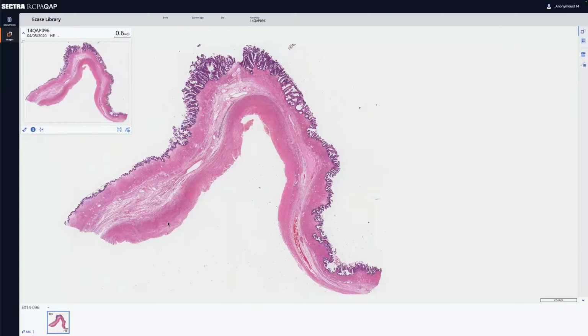And I would say if more than 10% looks borderline in the sampled material, call it borderline, because I think that is how the criteria was developed. And I think that when they developed it, they were still using the same practice as we do now, which is sample the dodgy looking stuff. But that's what I think.